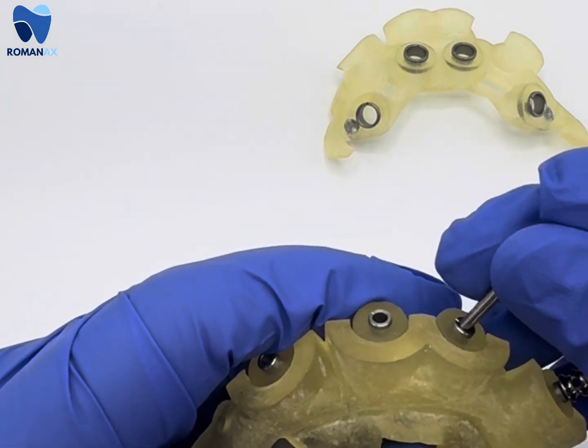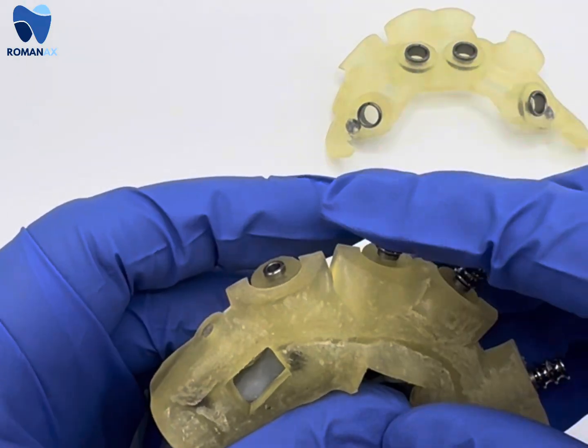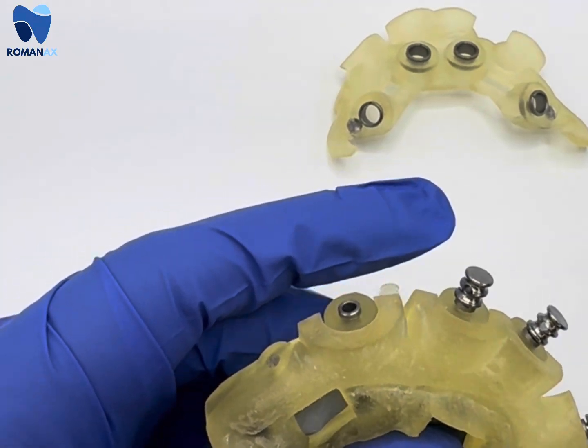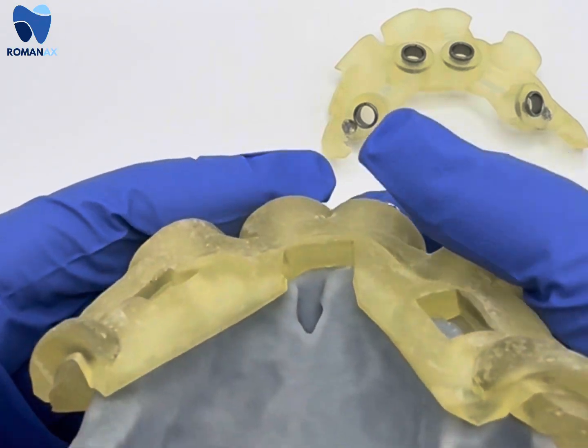We're going to be simulating the pins being drilled and then the pins being inserted into the bone. At this stage the pin guide does have locking pins that we could use to lock the pin guide to the bone reduction guide.